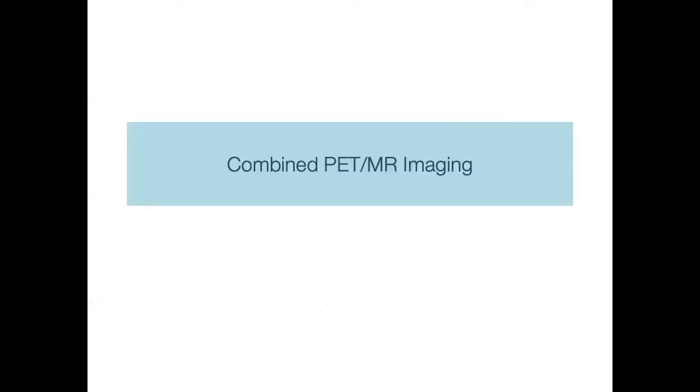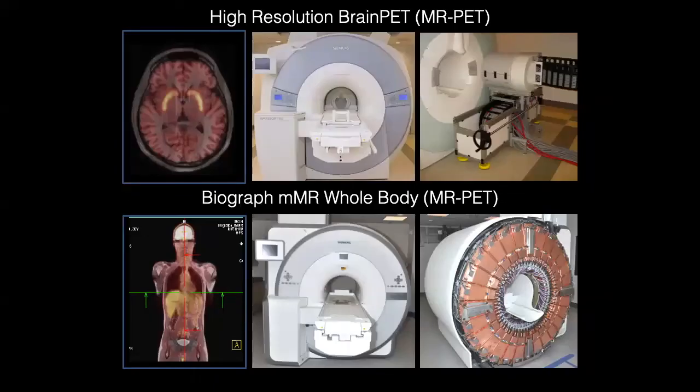All right, and I know we're almost up in time, so I just wanted to really quickly give you a couple of slides on combined PET-MR imaging, because here at the Martinos Center, we have combined PET and MR imaging. This is really a scanner that was introduced about a decade ago now, but is still a relatively new technology, especially in the clinical realm. And here at the Martinos Center, we have two human-sized PET-MR scanners, that's in Bay 6 and in Bay 7.